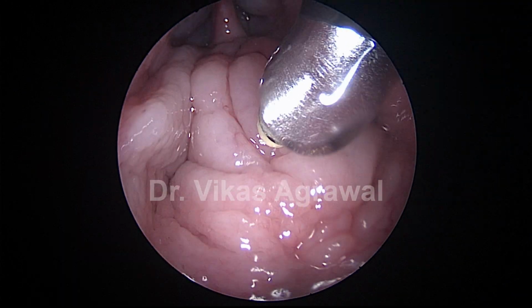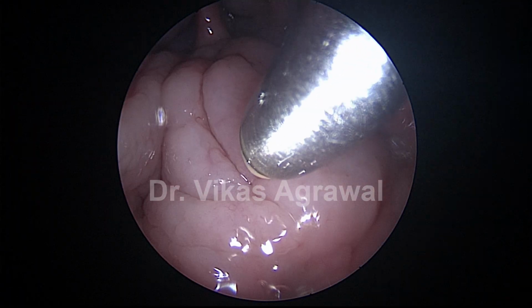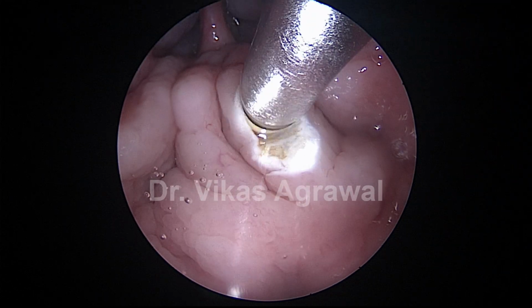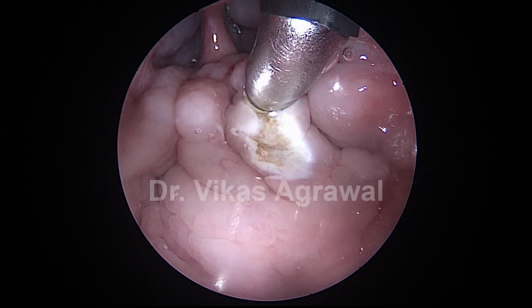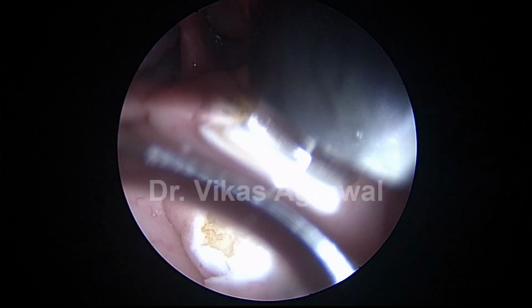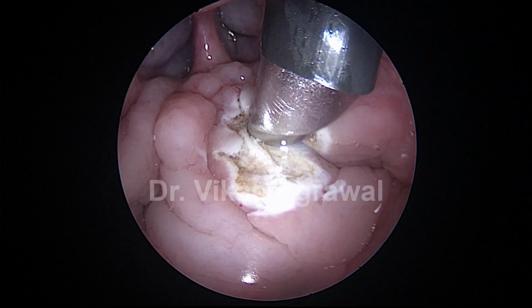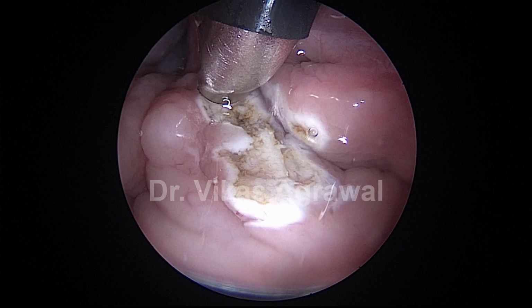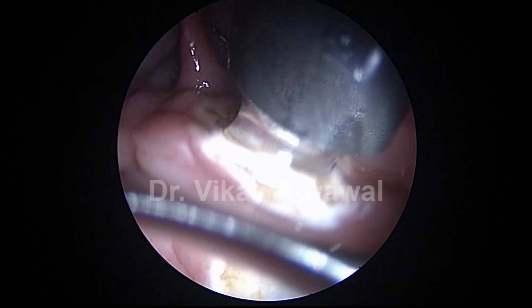So I'll first start by debulking. I'm using a 70-degree scope and going from inside the oral cavity, because in the nose there is no place for me to put the scope. The child is so small, the nasal cavity is also so small. So I'm just debulking the adenoid layer by layer using plasma coblation, and that's the choanal adenoid on the left side.